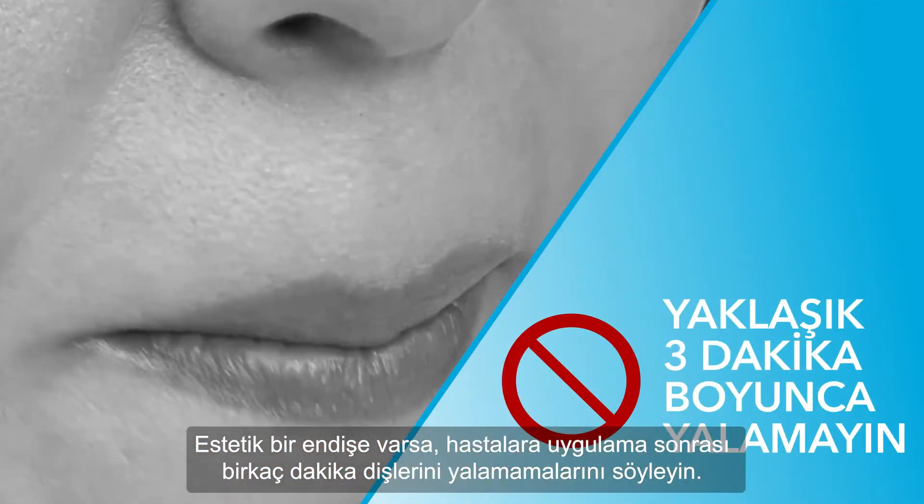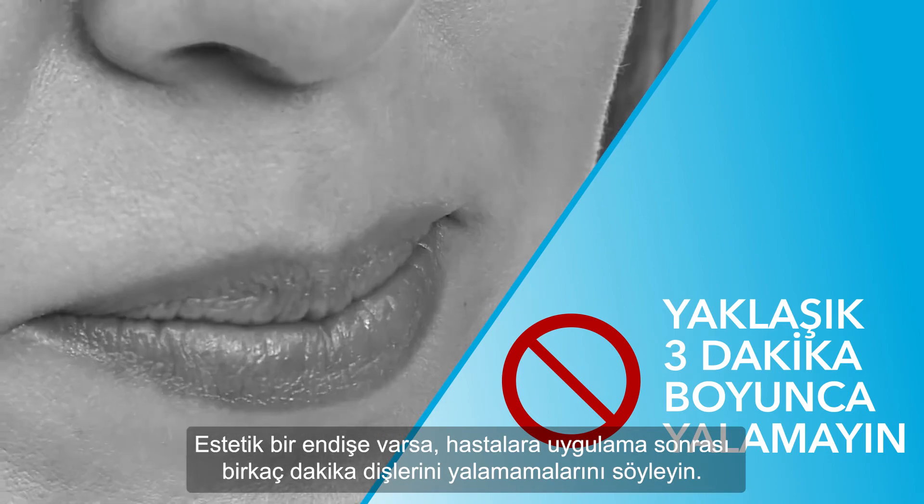If aesthetics is a concern, encourage patients not to lick their teeth for a few minutes after placement.